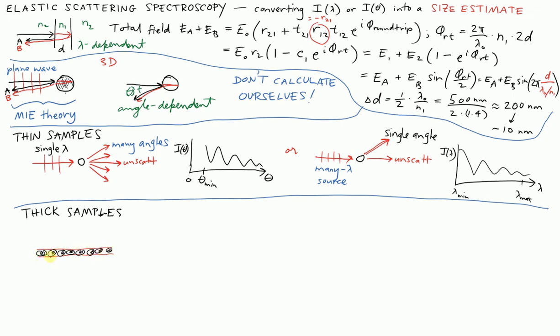And then underneath that, there might be some other tissue that we're not as interested in. So we might be wanting to study, say, cancerous developments in some lining area of the skin or the esophagus or various other places in the body. So the geometry of this measurement would be to do something in a backscattering mode. You'll see why in a minute.